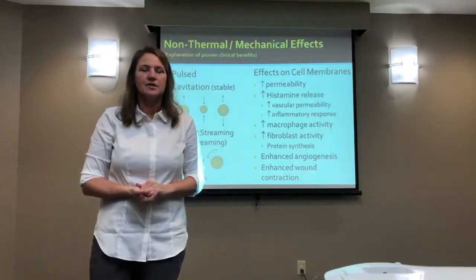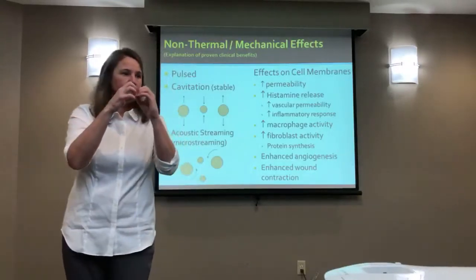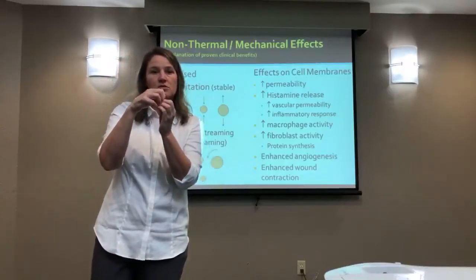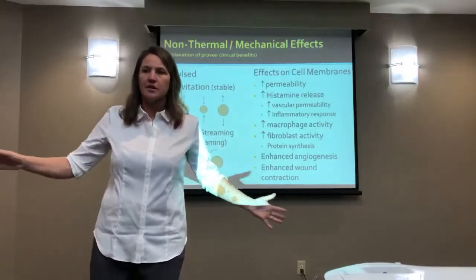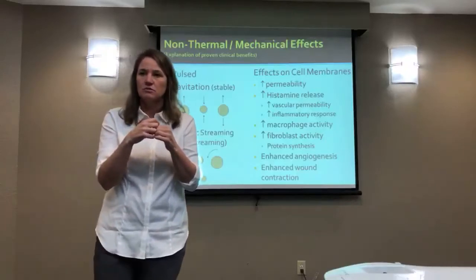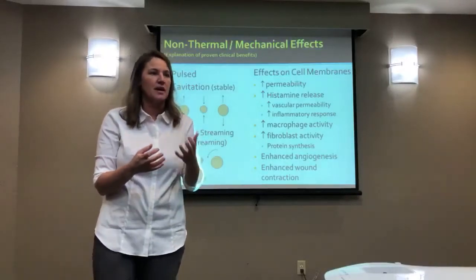When I teach edema management, one of my slides shows the idea of one cell connected to another. You said you do lymphatics, right? So when you think about this soft tissue and how it connects to a blood vessel or a lymphatic vessel, there's a connection. All of our cells are connected or we just fall apart. And so when you think about the pulling of those tissues back and forth, that can create inherent physiological benefit. So when you think about that vibration, that's what a lot of the benefit is being credited to, is the simple act of vibrating those tissues.